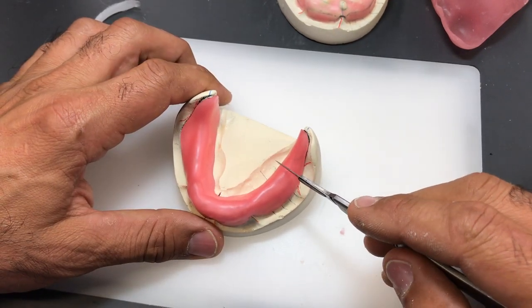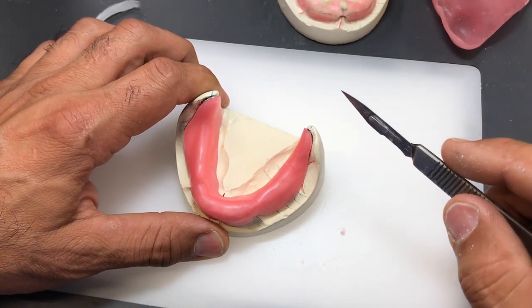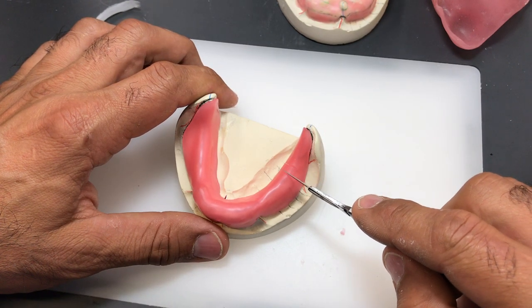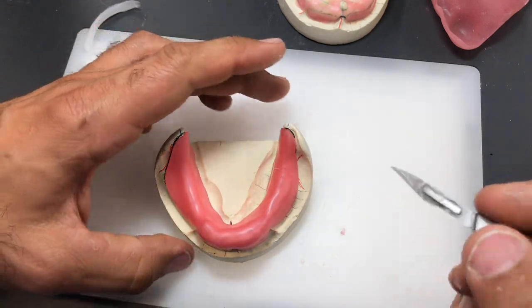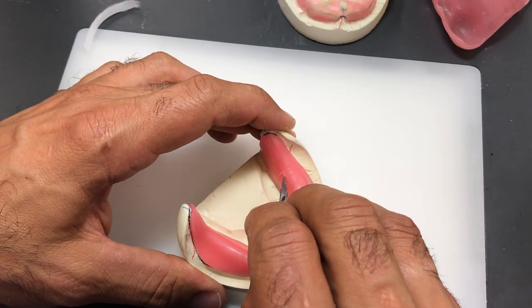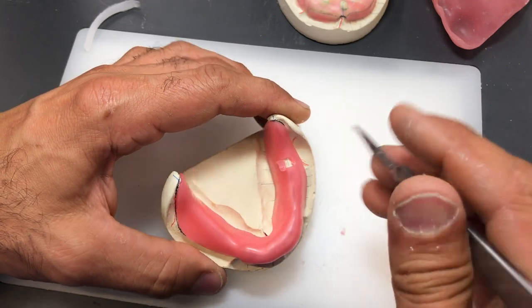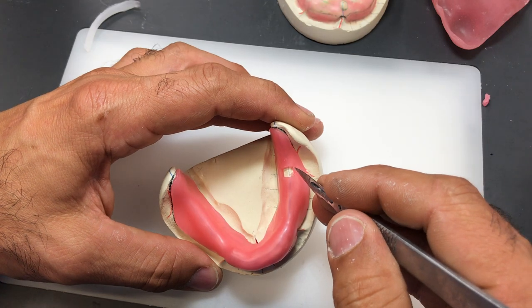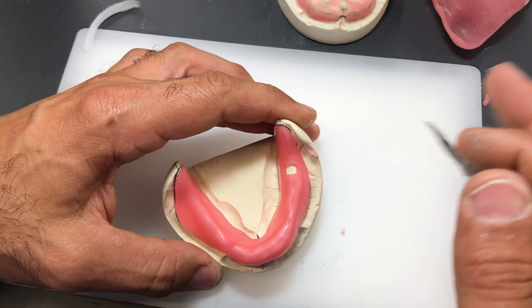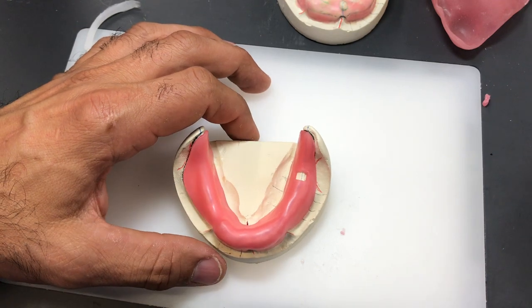So what I'm going to do is make a little slot here. And you see now the importance of the outline of the crest of the ridge. I'm going to make that opening, which is about a 5 by 5 millimeter opening, over the crest of the ridge to ensure that it creates stability of the tray while we're working through the border molding at the next clinical appointment.